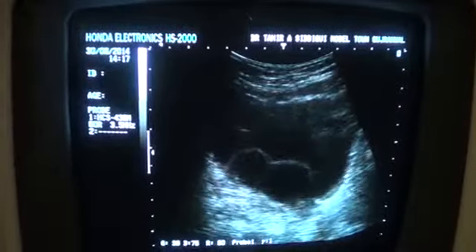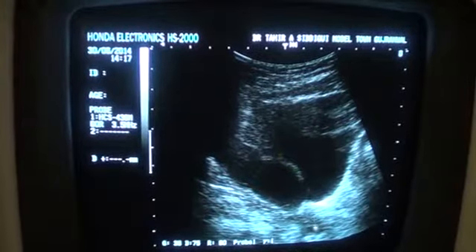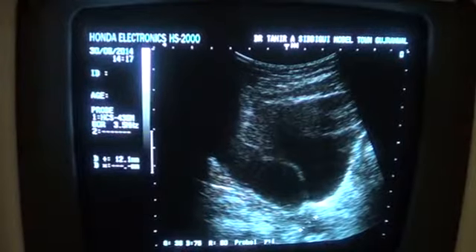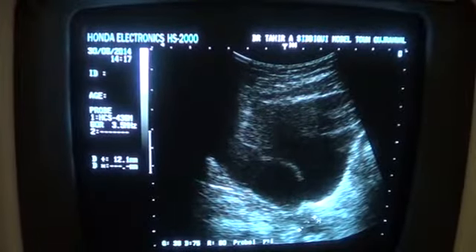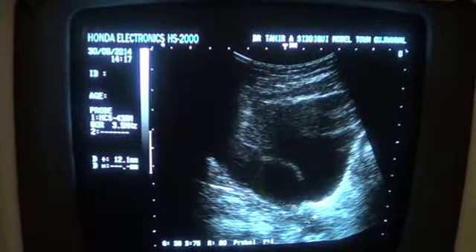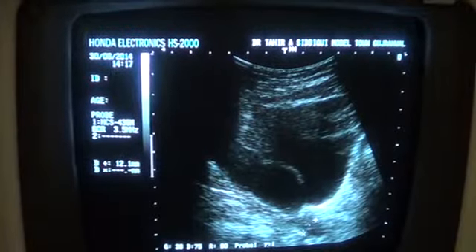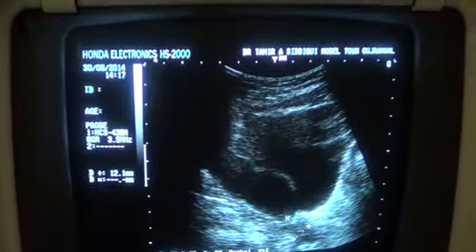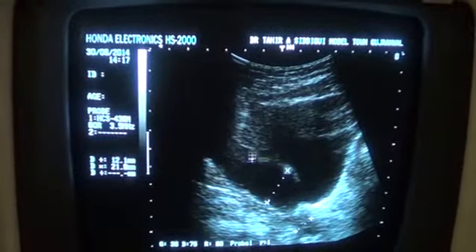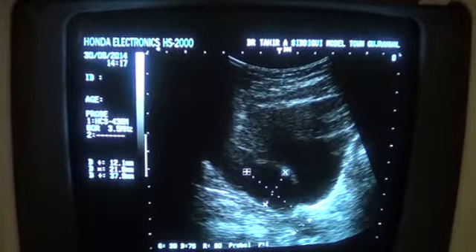Now let's see this. Follow this cystic area, and you can see this is the distal ureter. It is full of echoes, which is possibly a bleed or pus, and this is the thin walled cystic area, the ureterocele, and this is the ureter dilated up to 12.1, distal ureter, and this is the ureterocele extending from the insertion of the left ureter into the bladder.